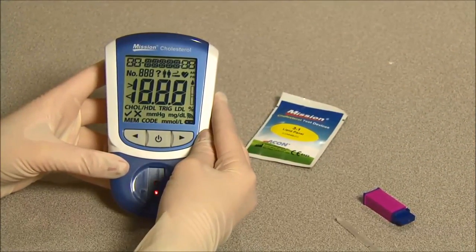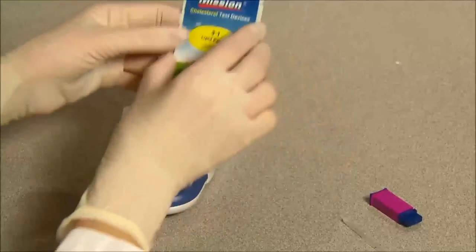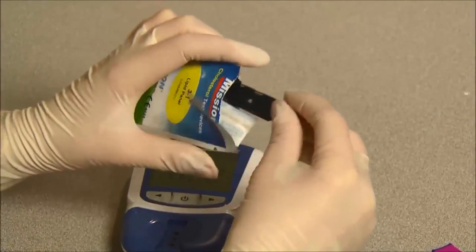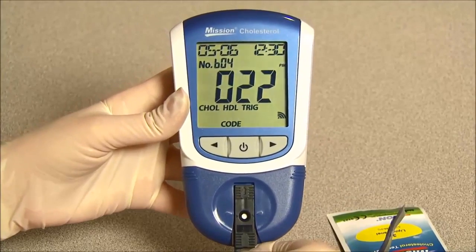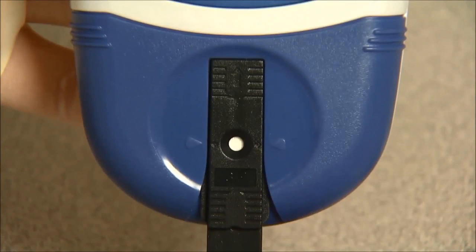Turn on the meter. To insert a test device, open the canister or tear open the pouch and remove one test device. Firmly insert the test device into the device channel in the same direction as the arrows indicate on the device. Ensure that the test device is inserted all the way to the end of the device channel until the position arrows are parallel with the two arrows on the device holder.